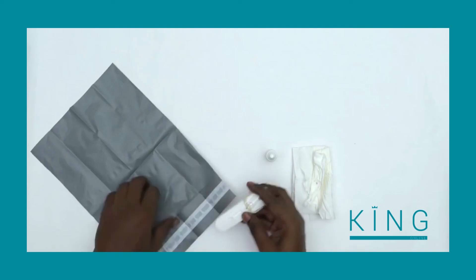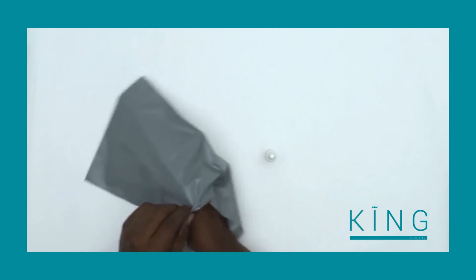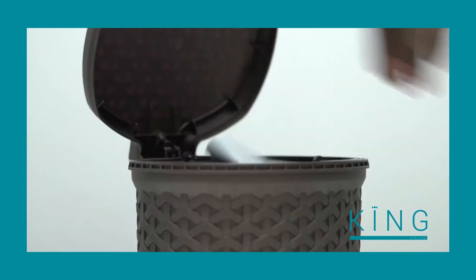Now that the test is finished, you can dispose of it by putting all the test materials in the plastic bag provided and placing it in a rubbish bin.